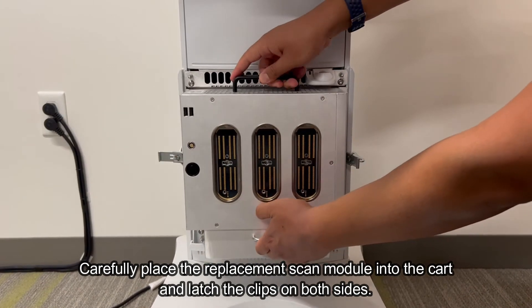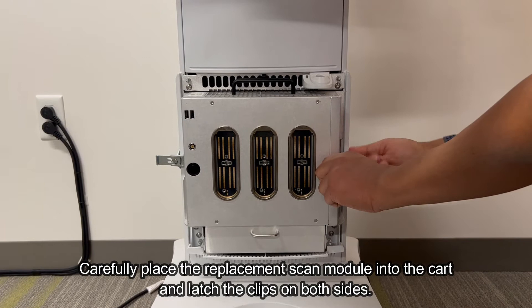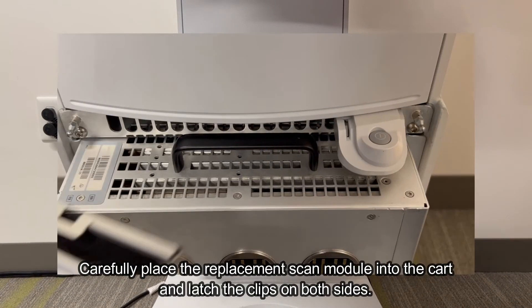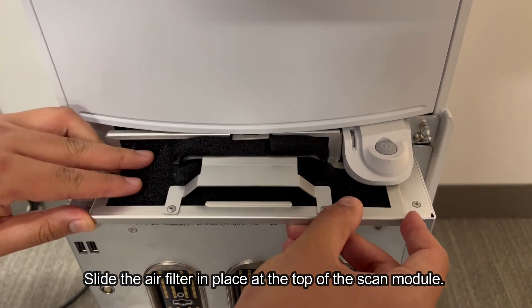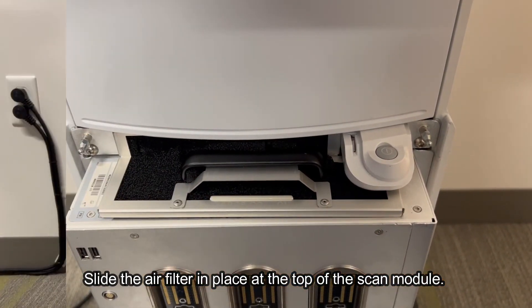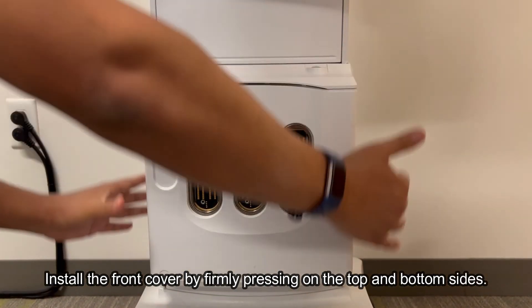Carefully place the replacement scan module into the cart and latch the clips on both sides. Slide the air filter in place at the top of the scan module. Install the front cover by firmly pressing on the top and bottom sides.